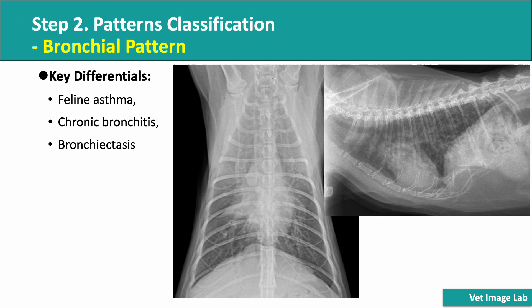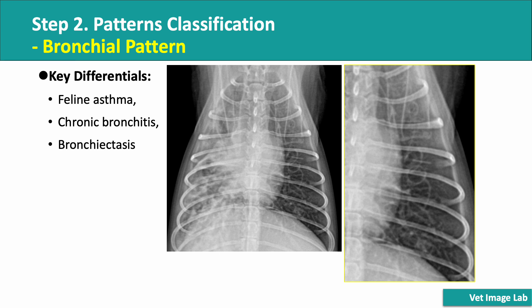Bronchial infiltrates are commonly seen in conditions like allergic airway disease such as feline asthma, chronic bronchitis, and bronchiectasis. This X-ray is a case of feline asthma; you can see the thickened bronchial walls making the airways more prominent. Because in many cases of feline asthma, interstitial infiltrates are also present, making the lungs appear dirty. If you focus on the left lung, you'll notice multiple round, ring-like patterns — a classic sign of bronchial infiltrates where thickened bronchial walls create the tramline and ring-like effect.